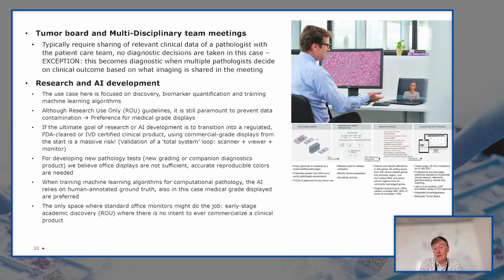So they always want to have full control over the chain from scanner to viewer to display. And if you have that all regulated, if it's an FDA cleared device or an IVDR certified clinical display, you don't have any risks because you know that this is okay, that you have the display under control.